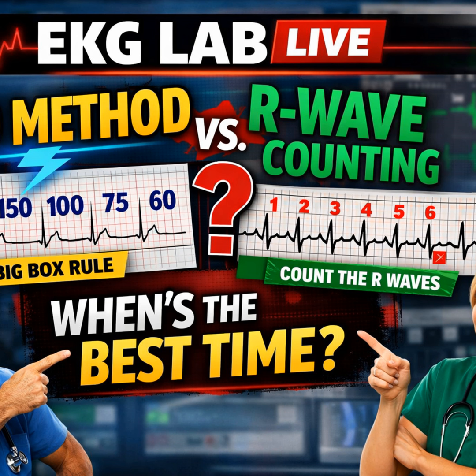But we aren't treating healthy hearts. We're treating sick ones. Let's look at atrial fibrillation. The UNC text describes it as having an undulating baseline and, crucially, an irregularly irregular RR interval. Granted, A-Fib is irregular. It's chaotic. So if I use your big box method on a patient with A-Fib, and I just happen to measure a short interval between 2 beats, I might calculate a rate of 110. Okay, but if I measure the very next interval, which is longer, I get 60. Neither of those numbers is the heart rate. They're both specific lies based on a single moment in time.